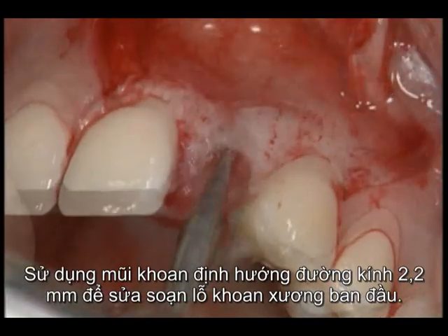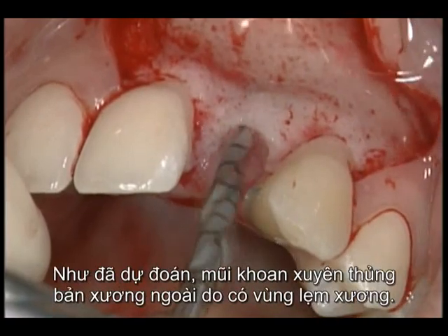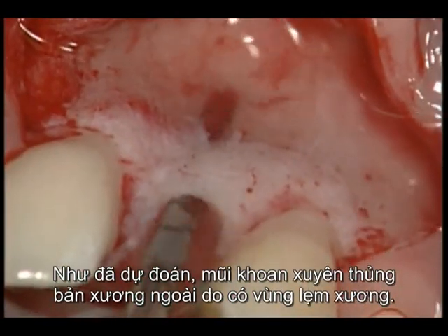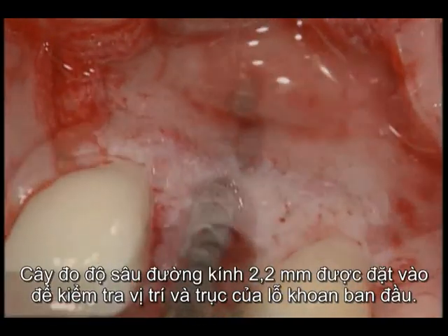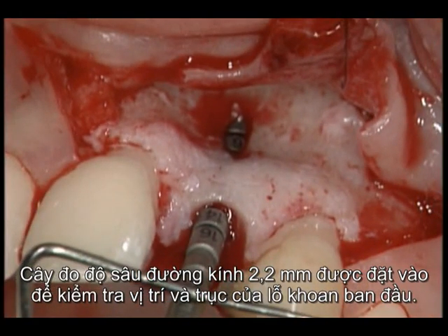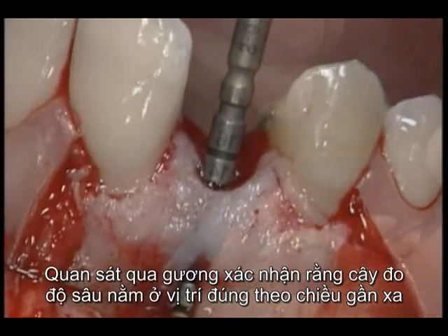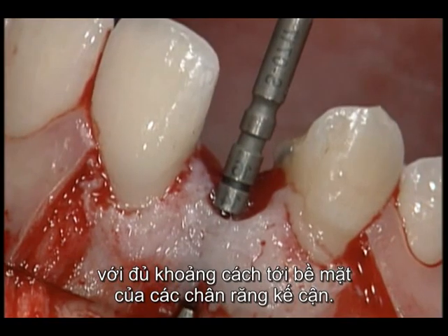A 2.2 millimeter diameter pilot drill is used for the initial preparation. As expected, the drill perforates the facial bone plate because of the bony undercut. A 2.2 millimeter diameter depth gauge is inserted to check the position and the axis of this first preparation. The mirror view confirms that the depth gauge is in the correct mesiodistal position with sufficient distance to adjacent root surfaces.